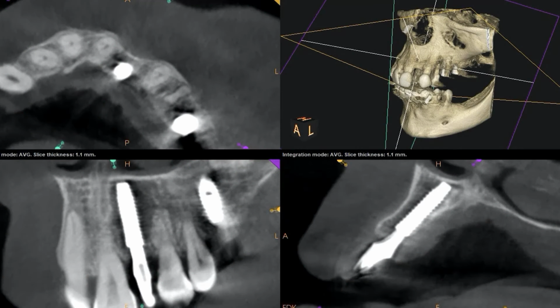Okay, here we are now looking at the post-operative CT scan. I always love this opportunity, now that I have a three-dimensional x-ray, to ask myself, knowing what I know now, what would I do differently and why? That little retrospective thought or conversation can be helpful in just making sure we're always optimizing our surgical outcomes, and not just surgery, but any procedure that we do in dentistry.